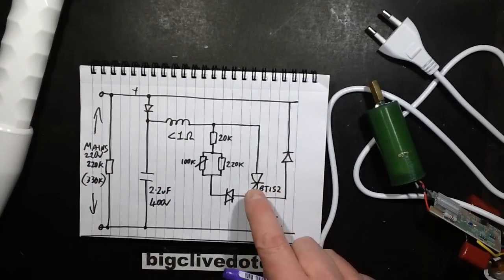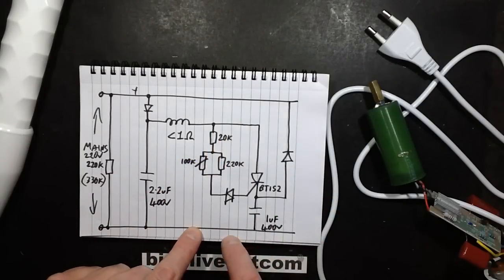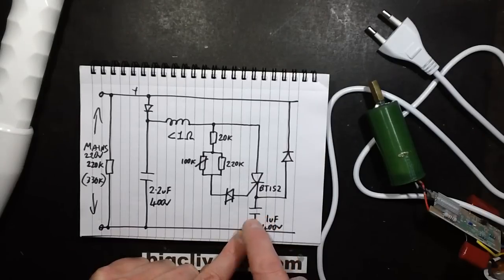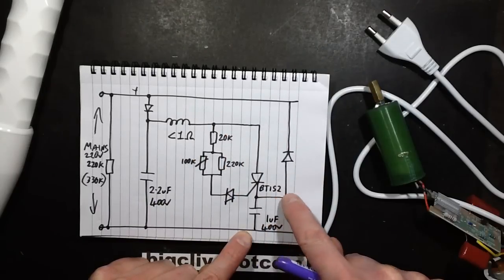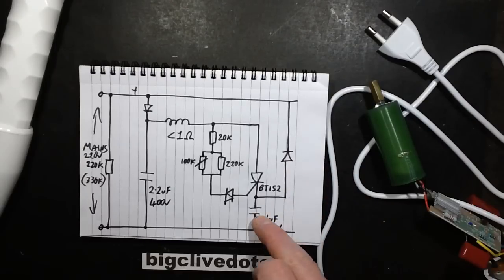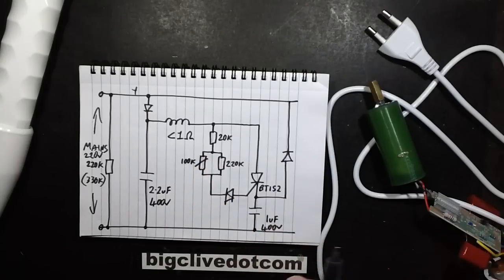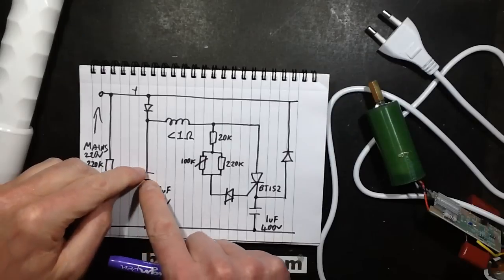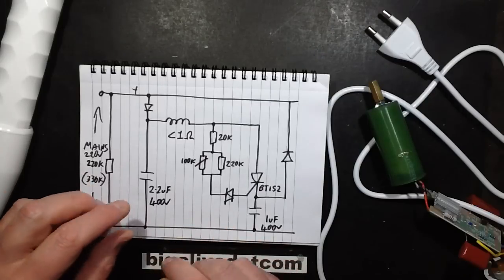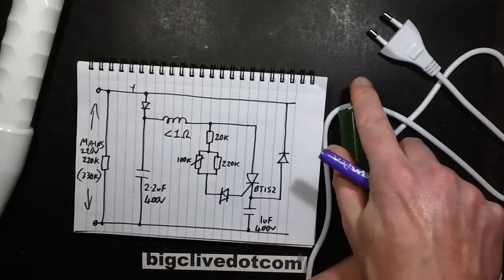At the zero crossing point, that thyristor turns off, and then when that side of the rail goes negative with respect to this level, this capacitor, which was fully charged during that positive cycle, then gets discharged via this diode. So that's all this diode does. Its full function in life is to discharge this capacitor. As you turn this resistor up in value, it means that progressively the voltage in this capacitor is going to get higher before that thyristor triggers, and it means you're going to get a lot more energy through. So as that potentiometer is increased in value, the output from this will gradually get progressively higher.